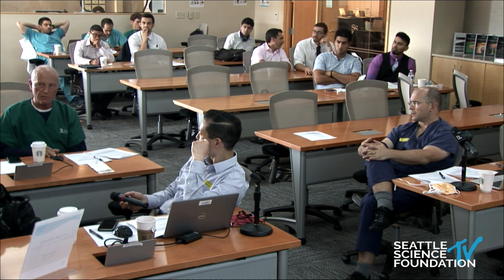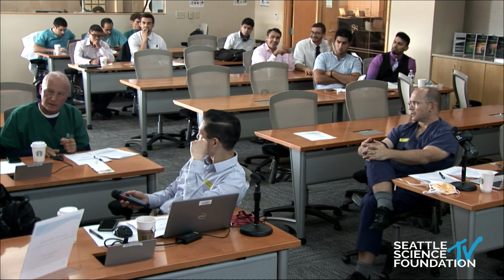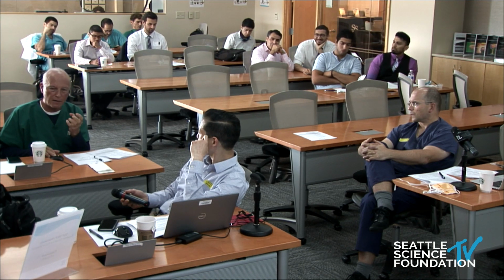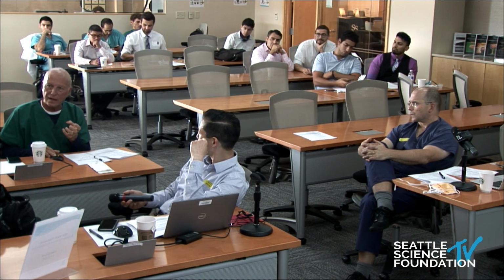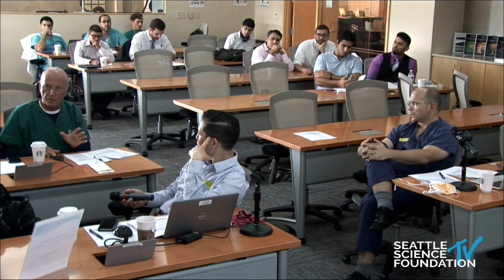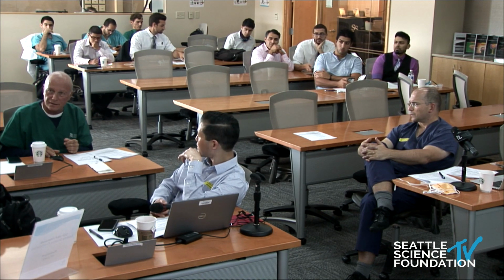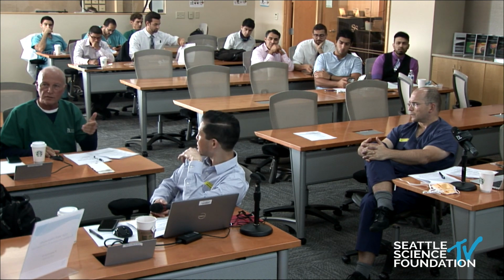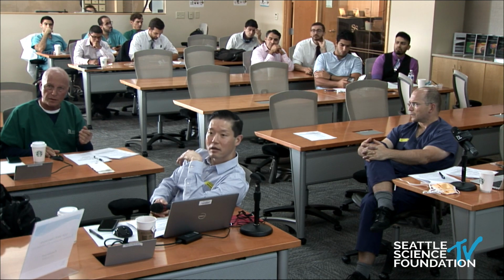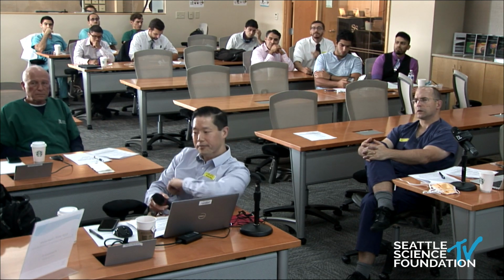It's the best thing I've ever done. I had a case last week that had a transmuscular approach, and the problem was the entire psoas atrophied and there was a huge plexus injury. Trans-psoas is a good operation done by the right people, but when it's done wrong, it really goes bad. This patient was in terrible pain and could not go back to the left side. So we went back to the right side and did a right side OLIF, retrieved the cage, and avoided that plexus and the psoas.